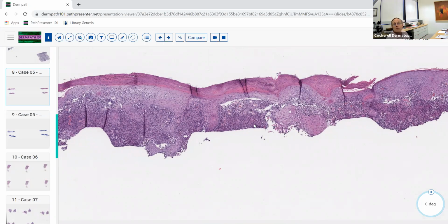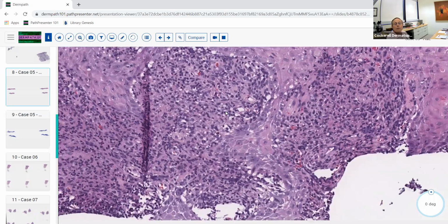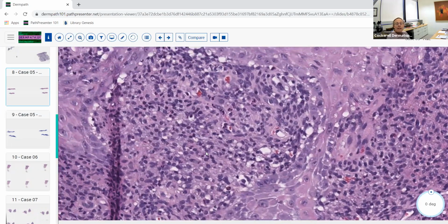If something looks like a cancer and you do a shave biopsy and it shows a granulomatous infiltrate in there, say, wait a minute, maybe it's not cancer, maybe it's an infection with pseudoepitheliomatous hyperplasia, or maybe it's pseudoepitheliomatous hyperplasia sitting overlying a granular cell tumor or something like that. So just keep that in mind when you get a shave biopsy that you think is cancer and it's not cancer. And the most common pattern, as you all know from the lectures we've given over the last year, is that the most common pattern of a deep mycotic infection or of an AFB infection or something like that is a suppurative granulomatous inflammatory response with or without overlying pseudoepitheliomatous hyperplasia.